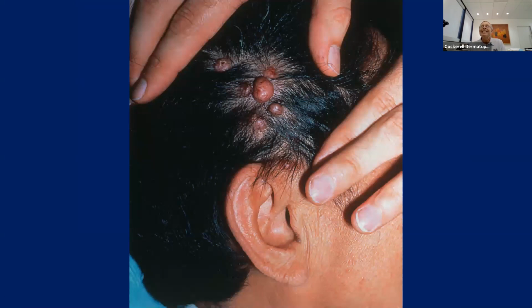So these are pretty easy ones for you today. We're not giving you anything that's really tricky so far. Hopefully these are just right down the middle of the fairway. I like to play golf, so these would be easy, obvious lesions that the board would expect, probably in the 90% plus range to get. These aren't tricky, pretty straightforward.